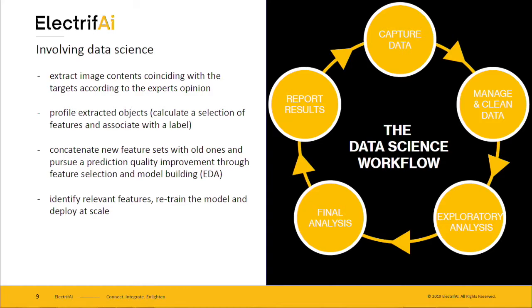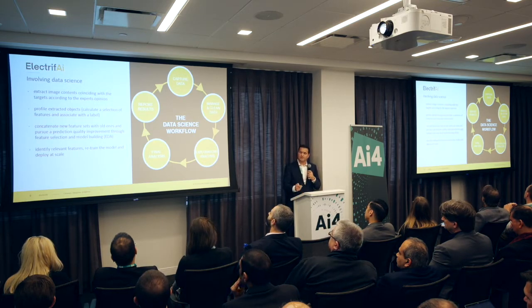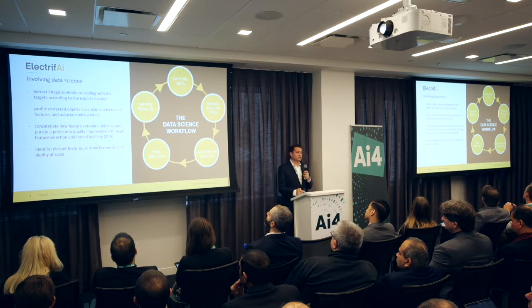We want to have the ability to profile the extracted objects. That means to calculate all the numerical features that describe it best. That can be size, shape, you name it. Then to concatenate the new feature sets with the old ones, and to pursue a prediction quality improvement through feature selection and model building.